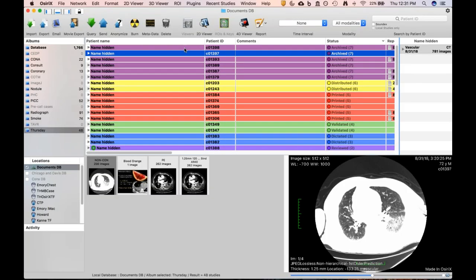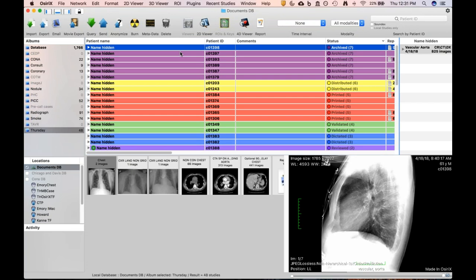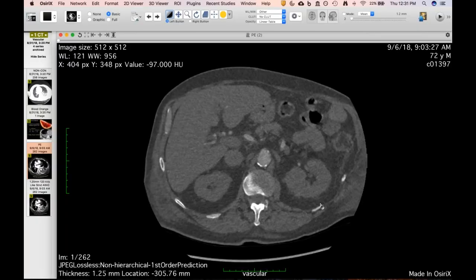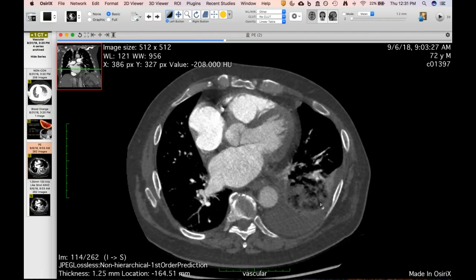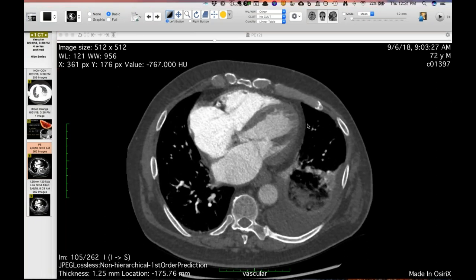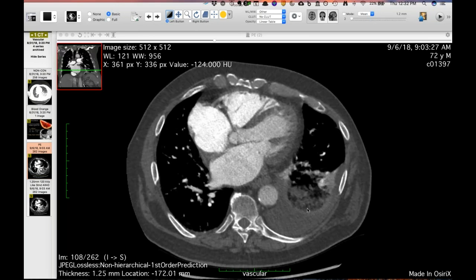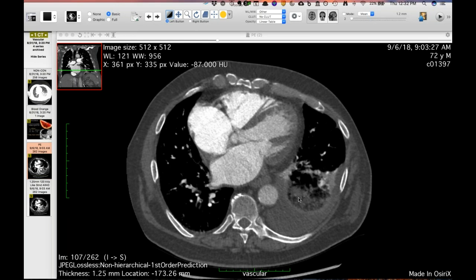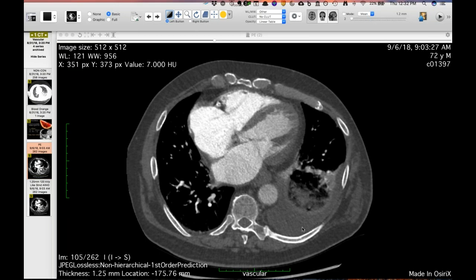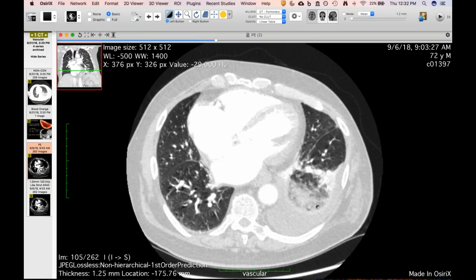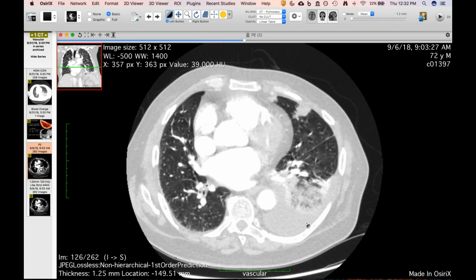One paper in Radiology looked at pneumonia versus infarcts and found air bronchograms more common in pneumonia. But I think the more important distinguishing feature is that pneumonia rarely gives you that rind of high attenuation with more uniform ground glass centrally — the blood orange sign. It's not a typical lobar appearance.